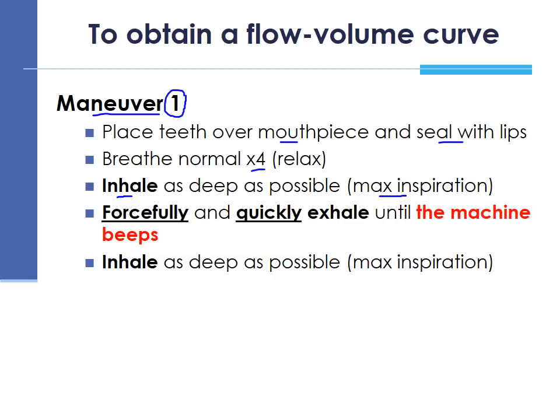And then this is where the main difference comes in the maneuvers. They are then instructed to forcefully and quickly exhale. So this is not just a complete exhalation, this is a forced exhalation. And this exhalation is also timed, so the software actually tells the patient when to stop exhaling. The machine makes a beeping noise, and that beeping noise is indicative of the end of the exhalation. After this forceful exhalation, they then inhale one more time as deep as possible.